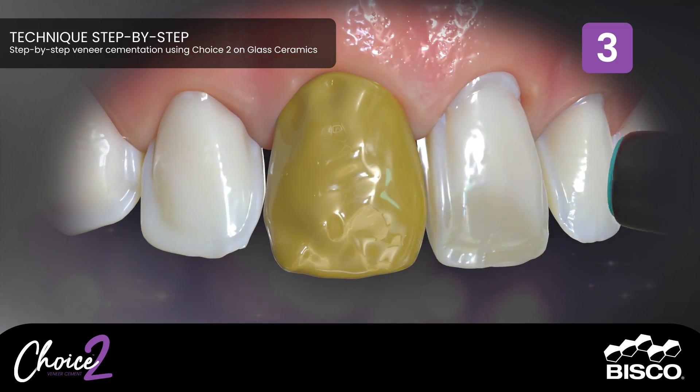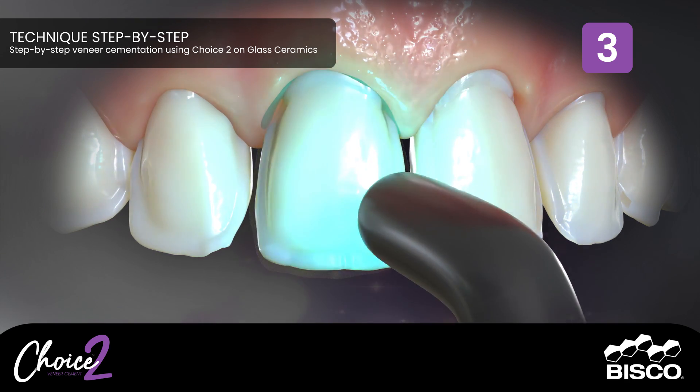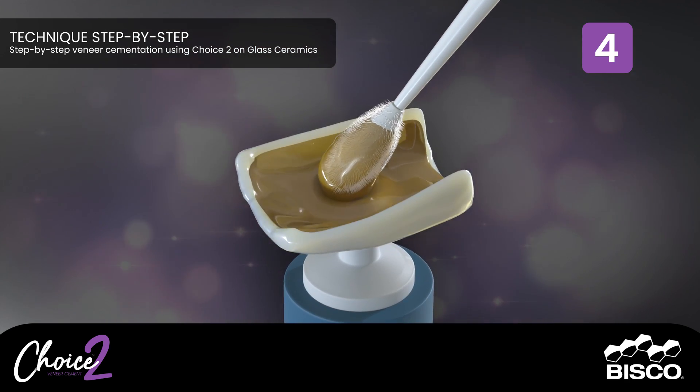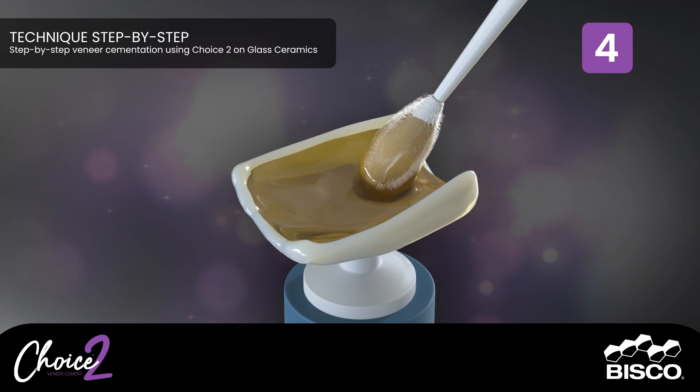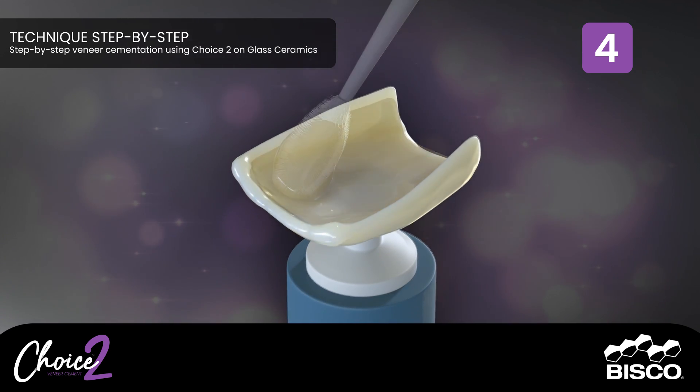Do not light cure between coats. Once the surface has a uniform glossy appearance, light cure for 10 seconds. Step Four: Etch the internal surface of the veneer with 9.5% porcelain etchant — 90 seconds for porcelain, 15 seconds for lithium disilicate.